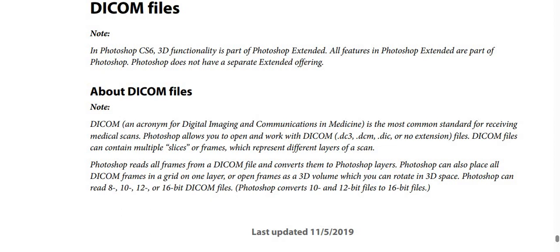DICOM files. So what about DICOM files? In Photoshop CS6, 3D functionality is part of Photoshop Extended, by the way, and all features in Photoshop Extended are part of Photoshop, and Photoshop doesn't have a separate extended offering.